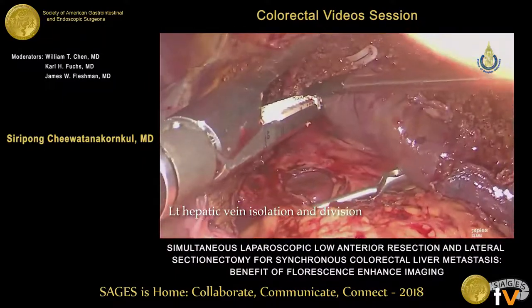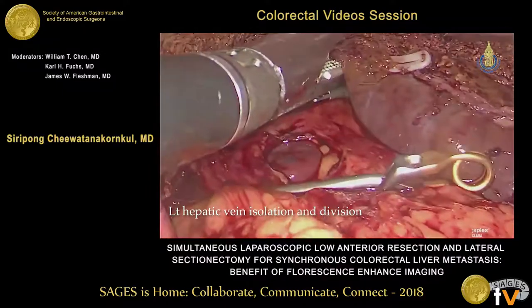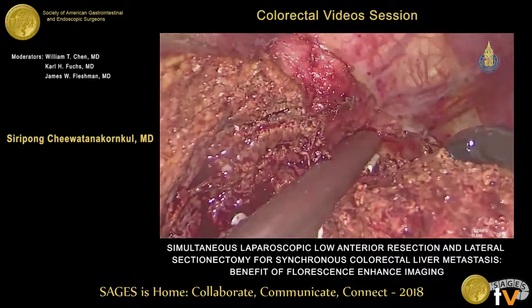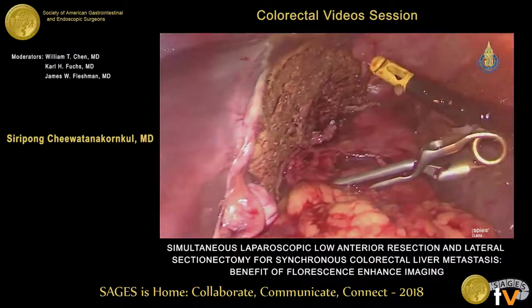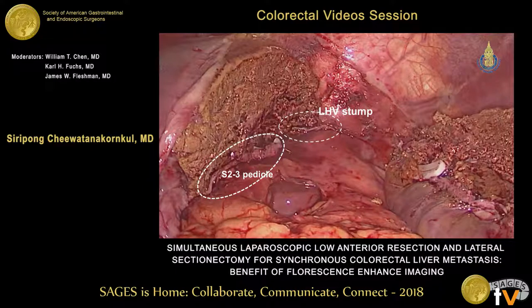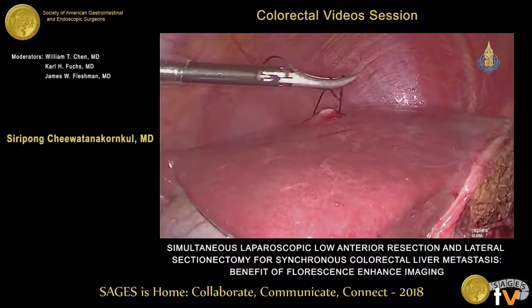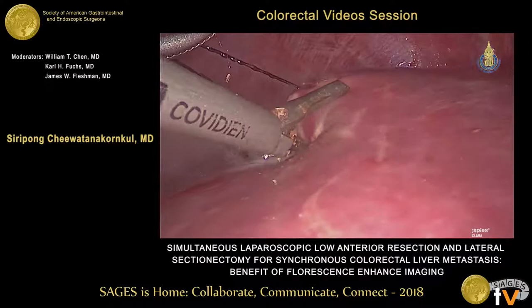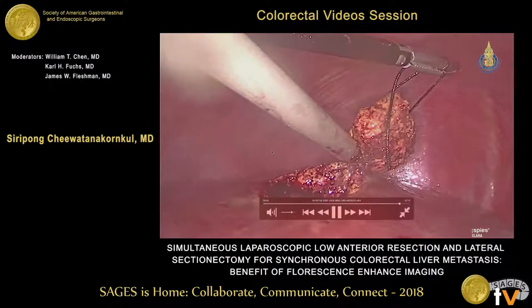Luckily, we can clear the tumor away from the left hepatic vein. We apply the white load. The margin is very far from the left hepatic vein. Here you can see the stump. We remove the Pringle. You can see the S2 and S3 pedicle stumps. We also accidentally found a nodule at segment 5. We think this is a metastatic nodule which could not be detected by CT scan before, but it can be detected by ICG. So we remove it as well.